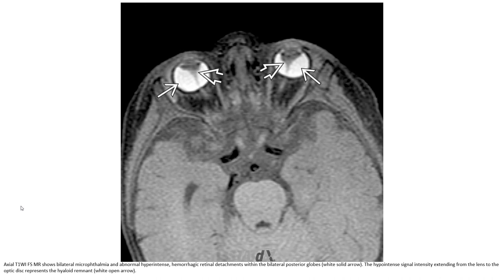This is another example of PHPV. The image shows bilateral microphthalmia and abnormal hyperintense hemorrhagic retinal detachment within the bilateral posterior globe. The hyperintense signal intensity is extending from the lens to the optic disc, representing the hyaloid remnant.